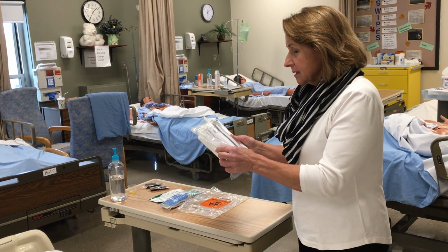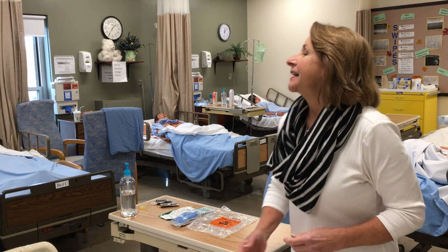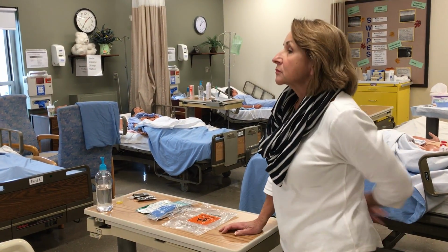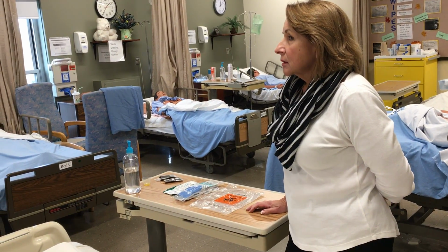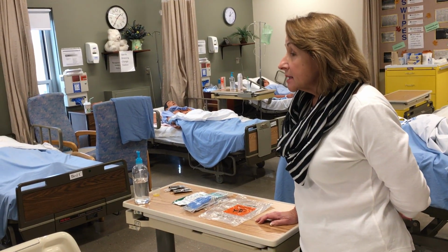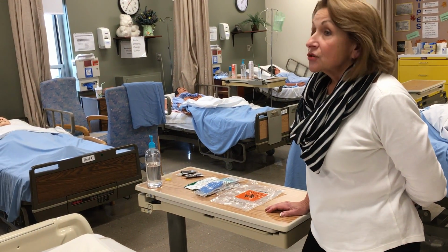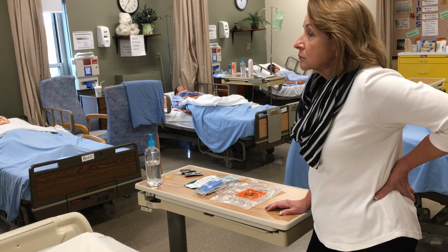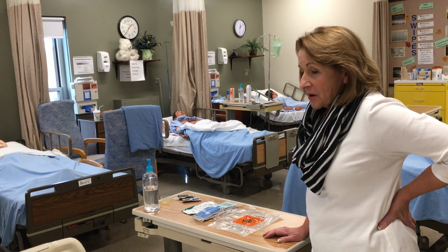All right, so what we're using is the Dover silicone-coated latex Foley tray. Denise, can you catch? Is it a good kit to use? What are you looking for? Expiration date. Fully sealed. It is sealed, it looks good. Different companies make different kits, so you always have to read the instructions and make sure you have everything you need. So tell me what's in there, Denise. What's the expiration date? 9/30/2019. We're good for a couple of years. All right, we're good to go.